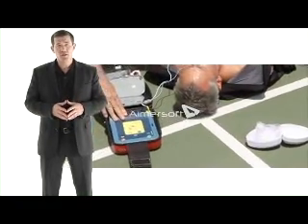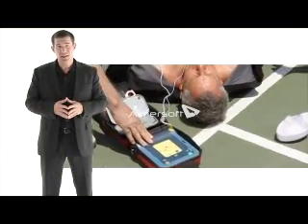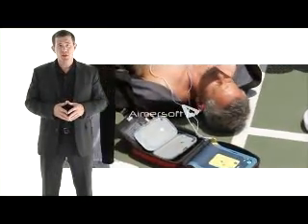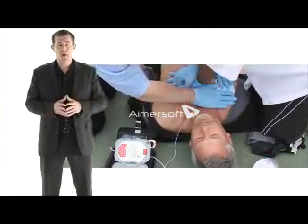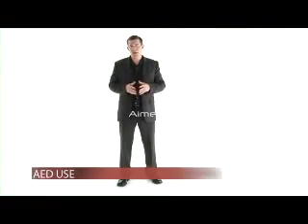A common question is, when do I use an AED? That depends on the situation and if the victim is an adult or a child. For an adult victim, use the AED immediately, as soon as it is available. Let's look at how to use the AED.